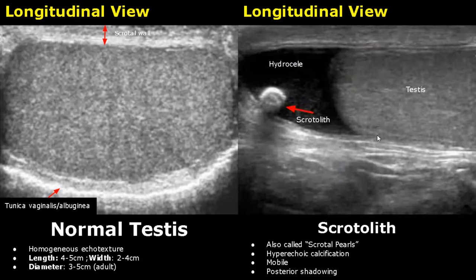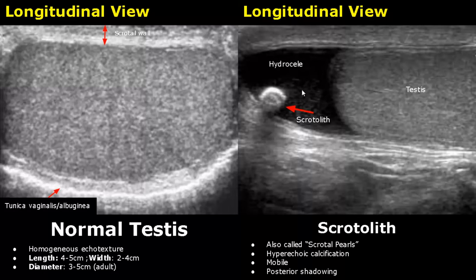A scrotolith is a calcification in the scrotal sac. It will appear hyperechoic and can be mobile. It often has posterior shadowing. In this image we can also see a hydrocele.